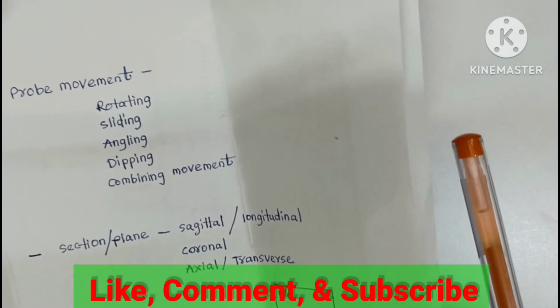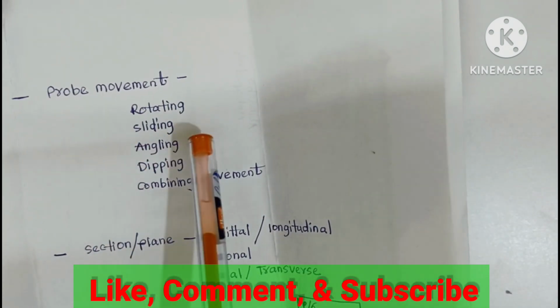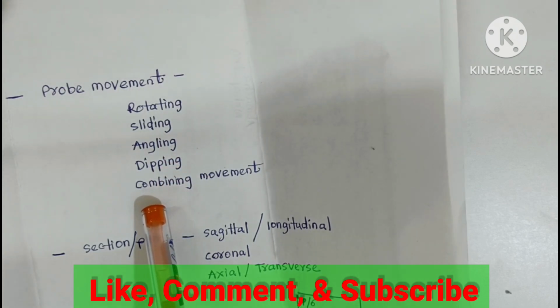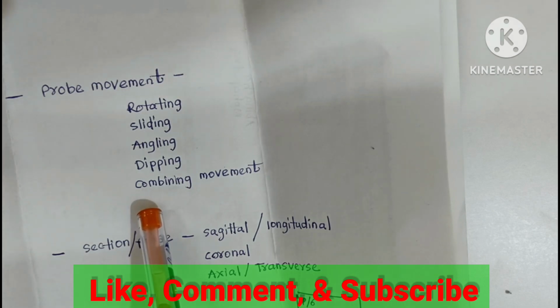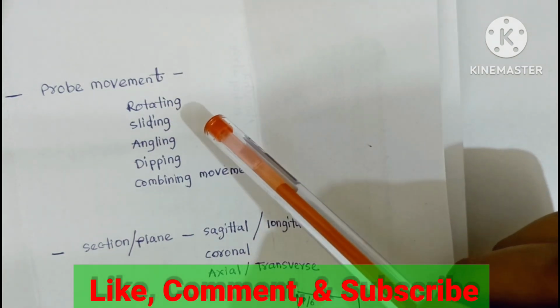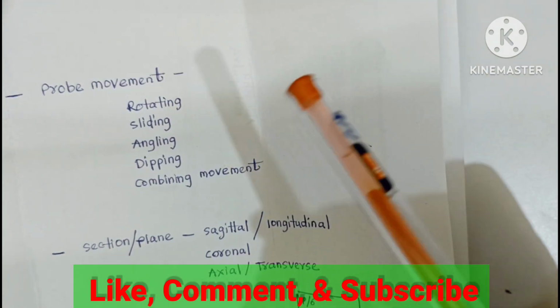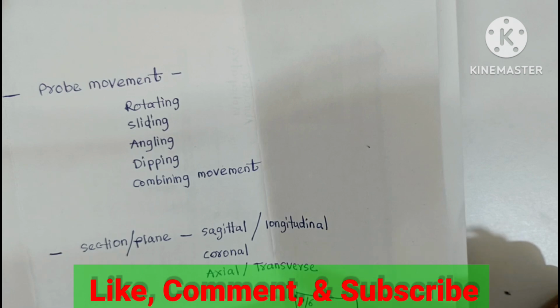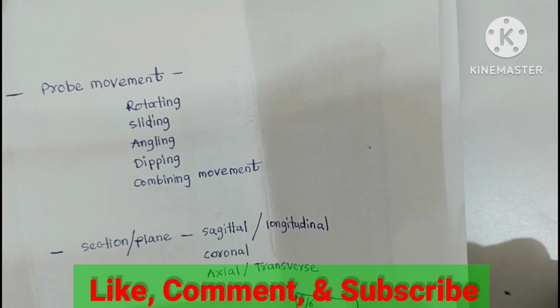There are generally five types of probe movement: rotating movement, sliding movement, angling movement, dipping movement, and combining movement, that is a mixture of all types of movement. First we will discuss the different axes of the probe. Any type of probe has two axes: one is the broad axis and one is the narrow axis.